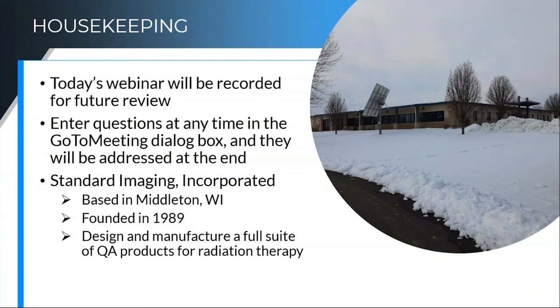Standard Imaging was founded in 1989 and has been growing ever since. We do design and manufacture a full suite of QA products right here on site.